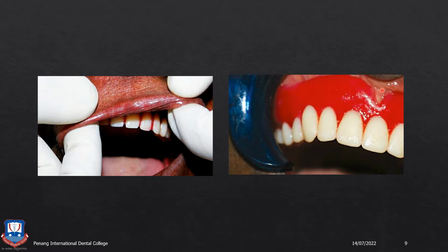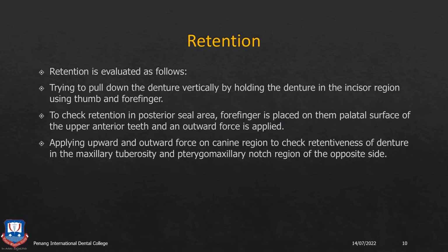All the proper frenum reliefs, like the buccal frenum and the labial frenum relief, should be given at this trial denture step, so that you show that the peripheral and the relieving structures have been properly and accurately recorded in the previous step. And of course, you also check for aesthetics such as fullness and labial fullness, all these things.